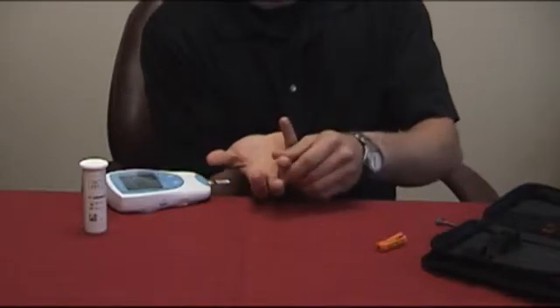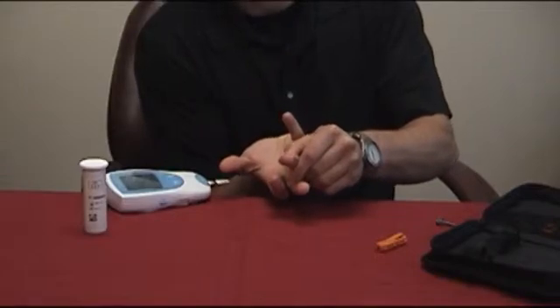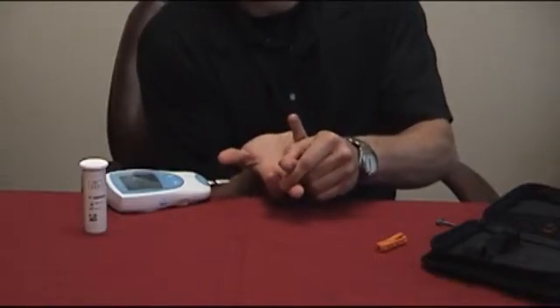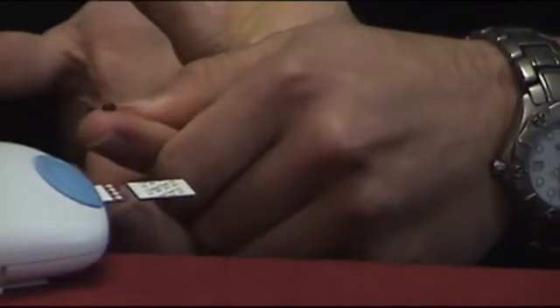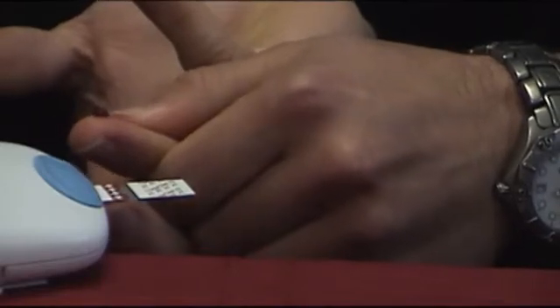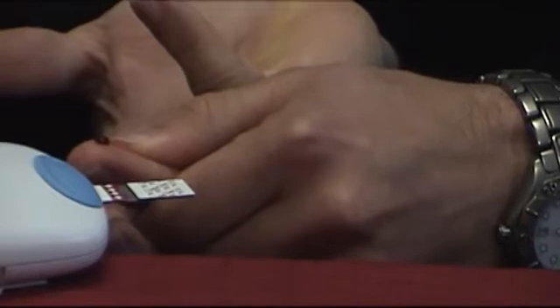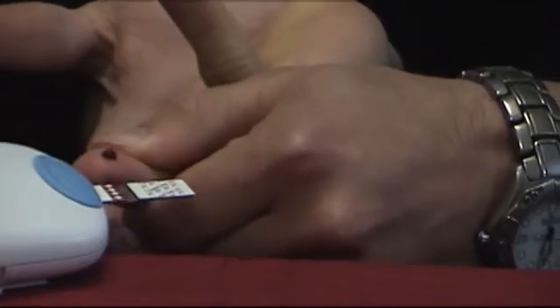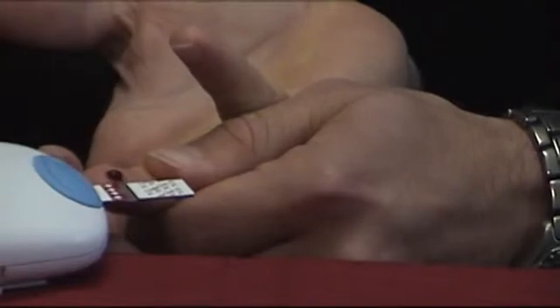Next, milk your finger by massaging the blood from the base of your finger up towards the tip until a ladybug-sized drop of blood has formed. Once you have enough blood, approach the test strip from the side, steadying your finger with the other hand. Once your drop of blood is next to the clear section of the test strip, simply tilt your finger until the blood touches down on top of the clear section.